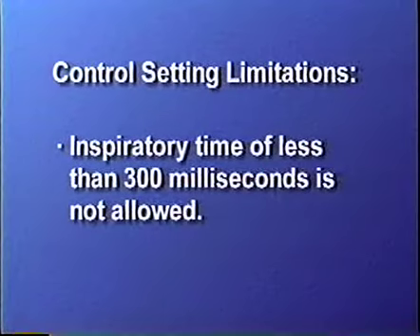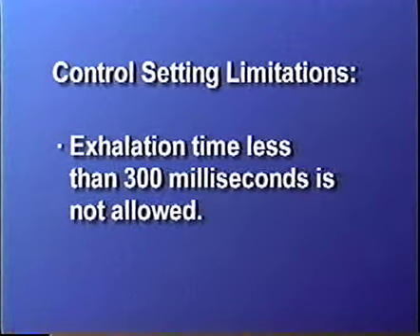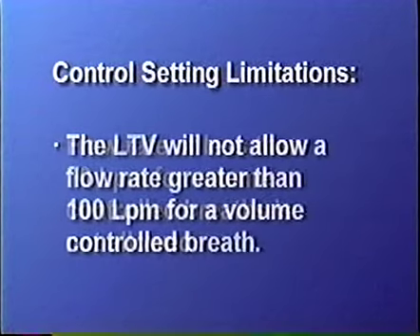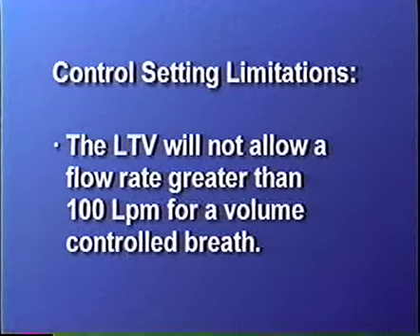The LTV will not allow an inspiratory time less than 300 milliseconds. The LTV will not allow an exhalation time less than 300 milliseconds. The LTV will not allow a flow rate less than 10 liters per minute for volume-controlled breaths. The LTV will not allow a flow rate greater than 100 liters per minute for a volume-controlled breath.